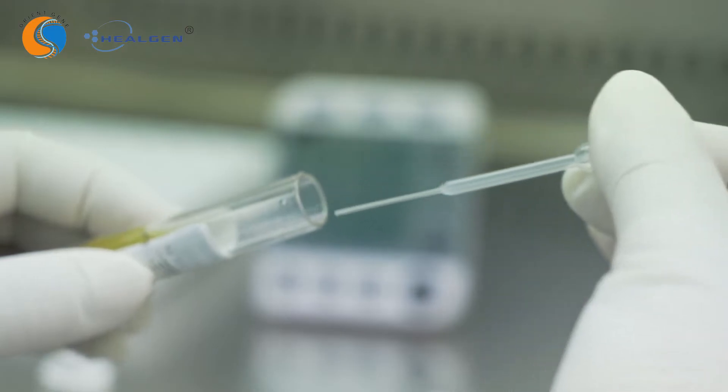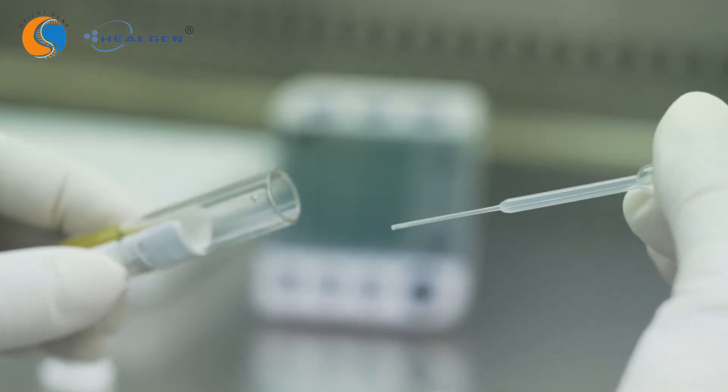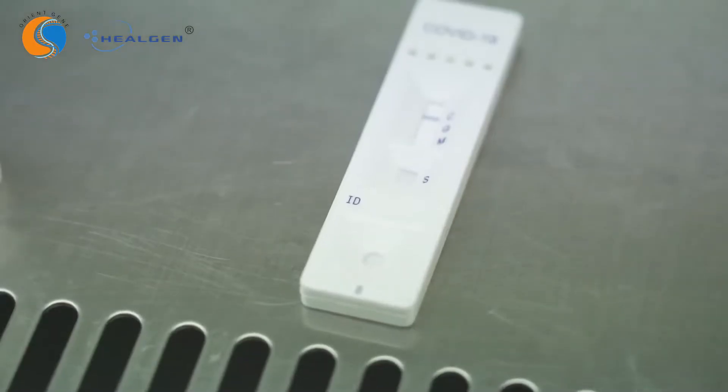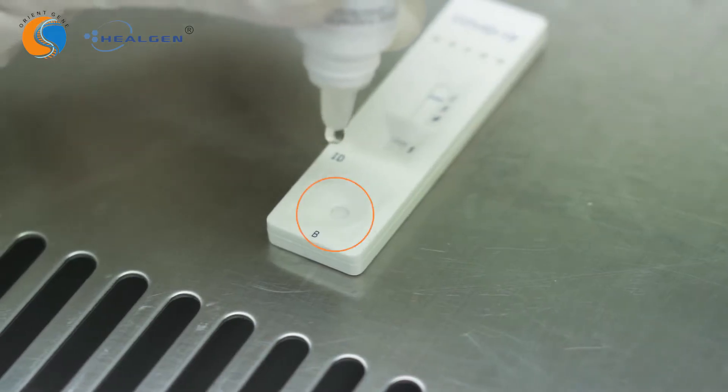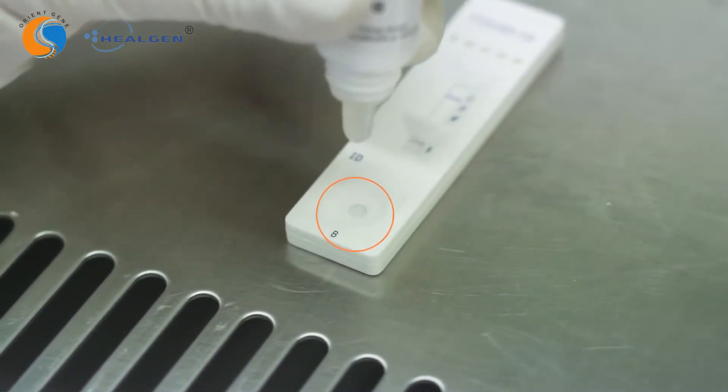When using a disposable dropper for serum or plasma specimen, draw a specimen until it reaches the specimen line. Hold the dropper vertically and transfer one drop of drawn specimen into the sample well, labeled as S, on the test cassette. Then add two drops of buffer to the buffer well, labeled as B, immediately after.